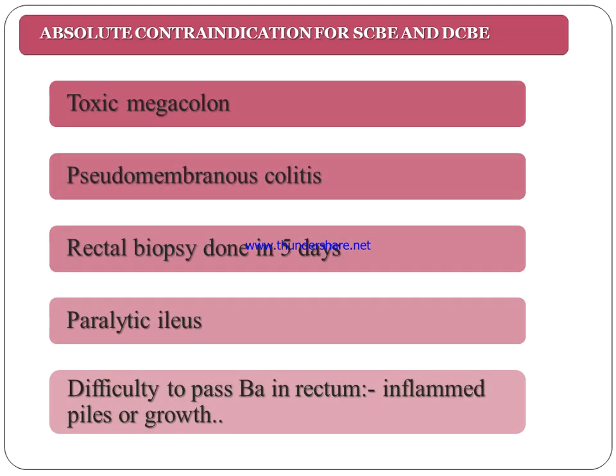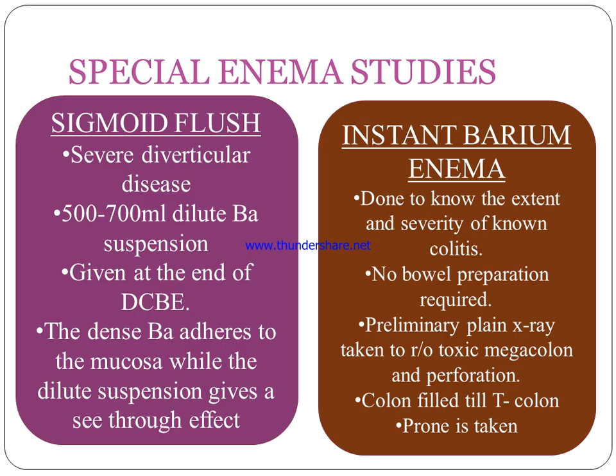Absolute contraindications for SCBE and DCBE, meaning single contrast barium enema and double contrast barium enema, are toxic megacolon, pseudomembranous colitis, rectal biopsy done within 5 days, paralytic ileus, difficulty passing barium into the rectum, and inflamed piles or growth.